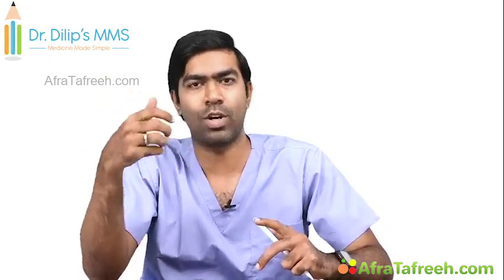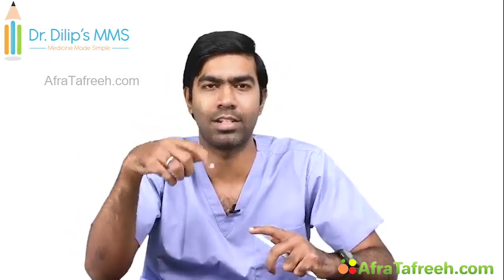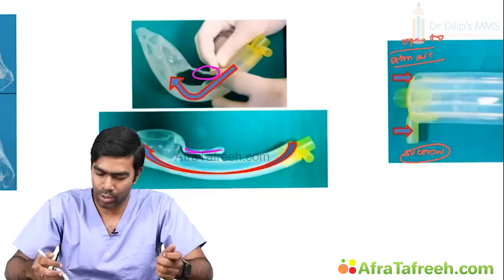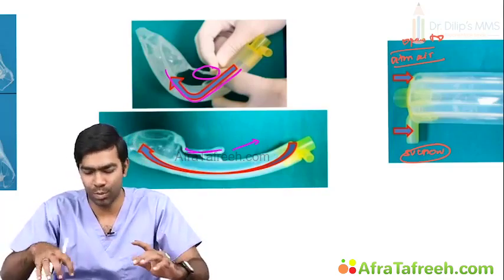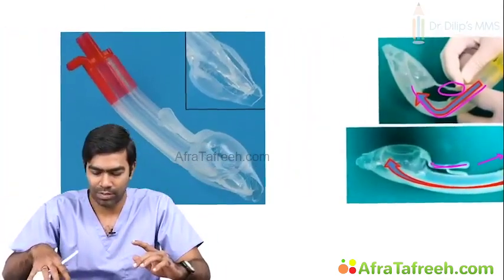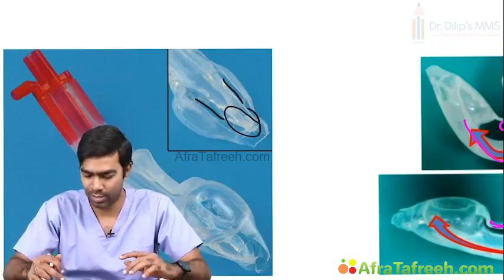Using this tab, once you are inserting this device, if you cannot insert any further and you are finding resistance, you can put your hand and pull this tab a little bit towards you so that the device will get more curved and will easily move into the curvature of the oropharynx. You can see here, once I pull this tab, it automatically becomes more curved. So these are all beautiful integrations. A lot of things have come with the Baska mask. These are the two drain ports you have for the gastric drain, and this is the general gastric sump you have near this area so that you can take it out.